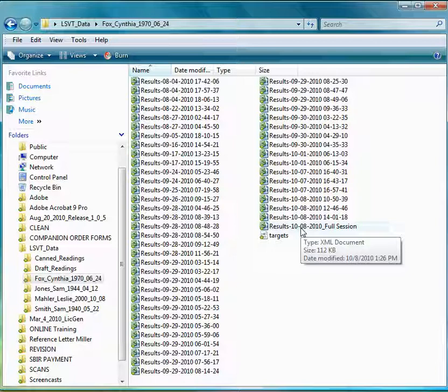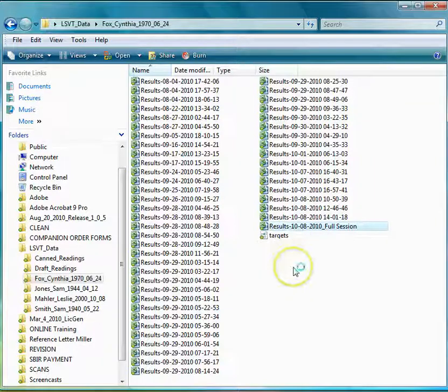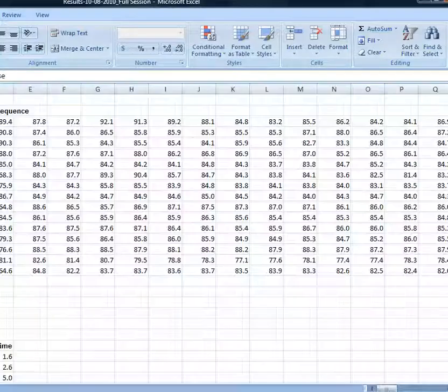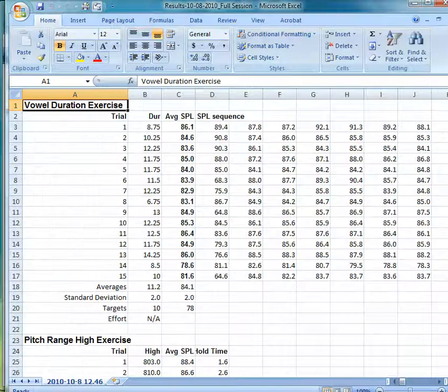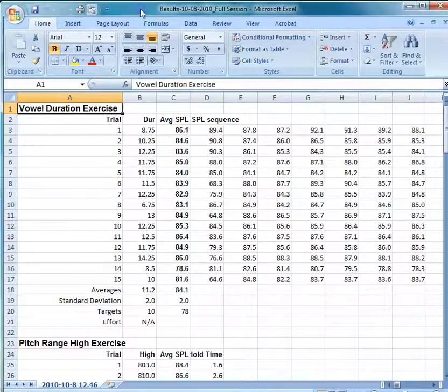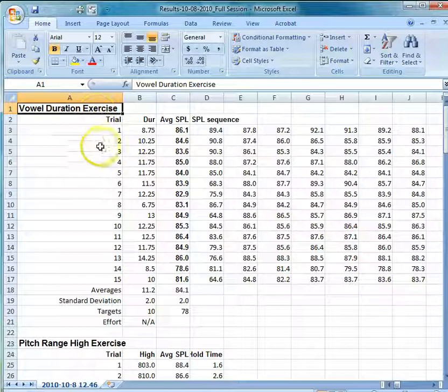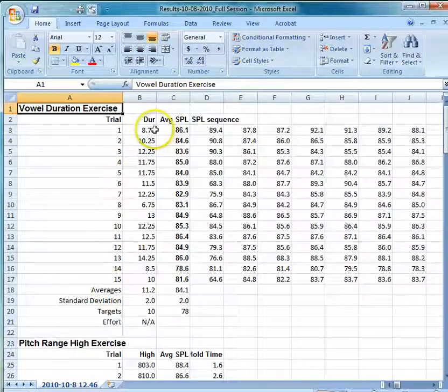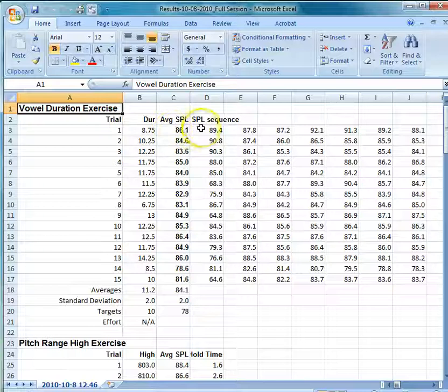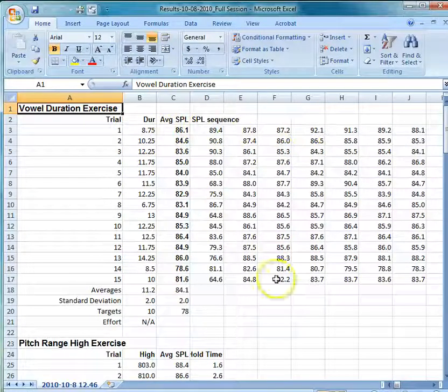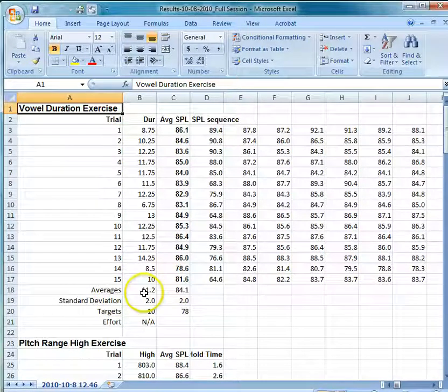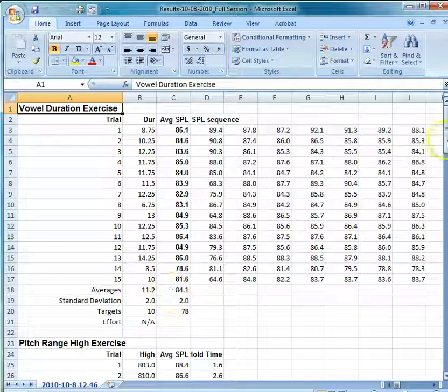You can open up the session — we'll use this one as a demonstration — and see how the data were collected. What you see is the vowel duration exercise. We did 15 trials. It has the average duration and sound pressure level per trial, as well as the entire SPL sequence. At the bottom, it has the average of the 15 trials, both for duration and sound pressure level.